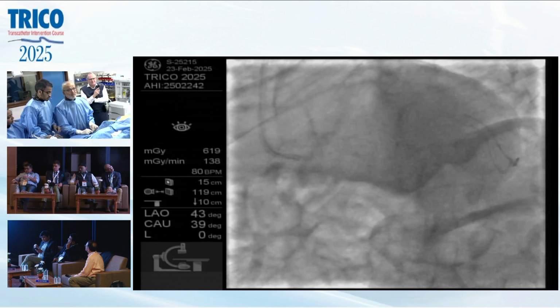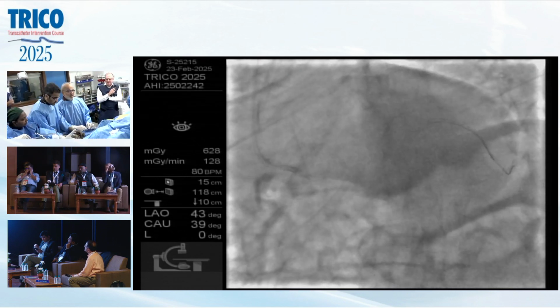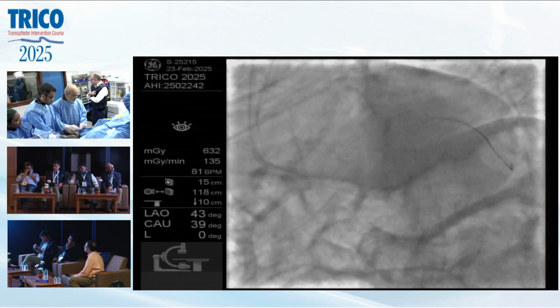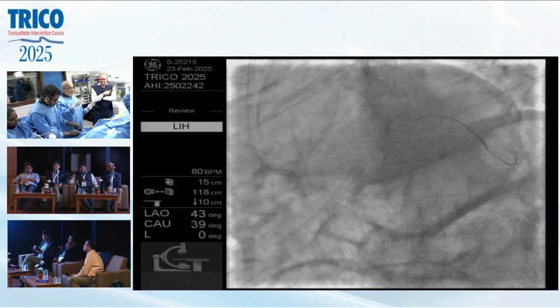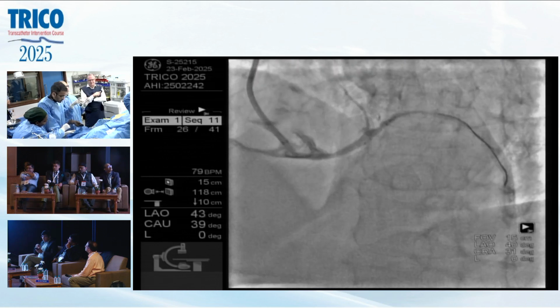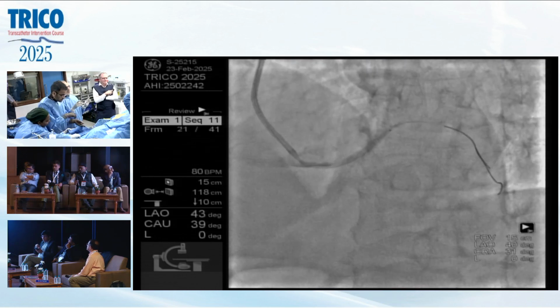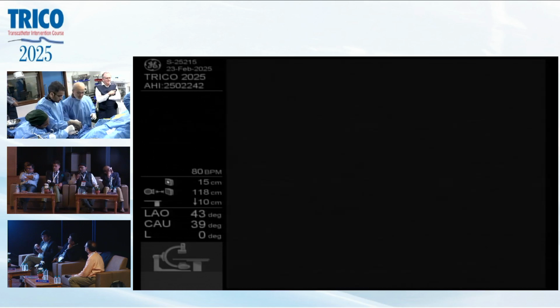Only issue, Malcolm, here is that I am not very good at IVUS interpretation. I feel that I'm more experienced with OCT interpretation. So here OCT is a challenge for me because the lesion is very distal, and getting the tip of the OCT catheter there, the first tip, is a major problem.